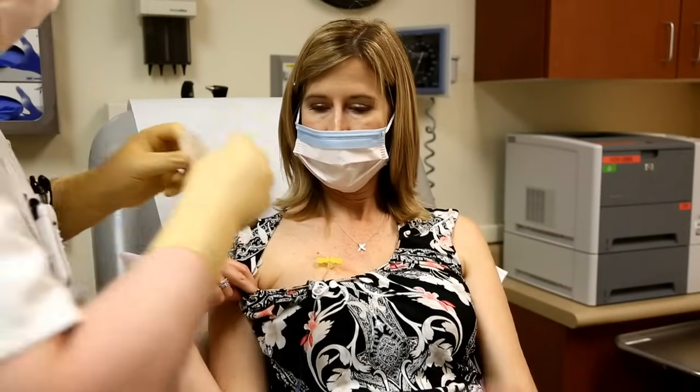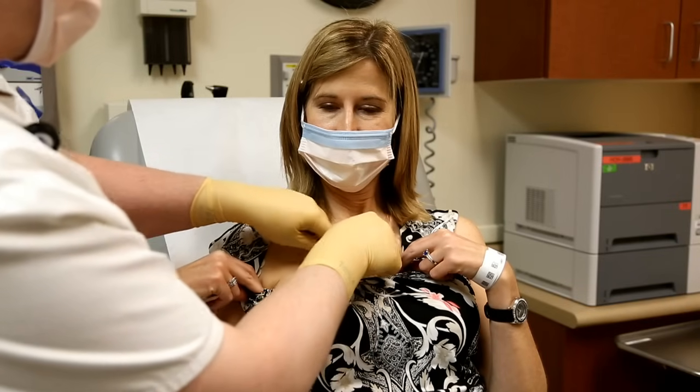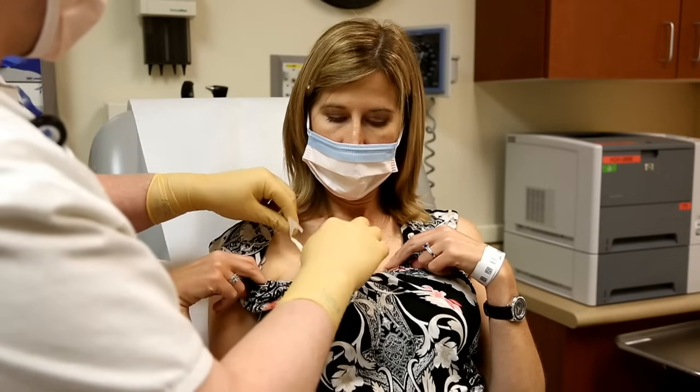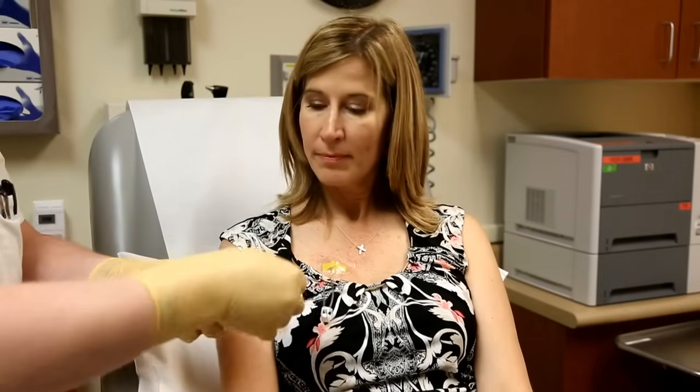We'll put our little covering over here. Does that feel okay? Yep. Once this is on and it's covered I can take this pretty mask off. One thing I recommend: make sure whatever you're going to wear when you're having your port accessed that it's easy. Otherwise I've seen people wear high-neck things and it makes it very awkward, so I try to plan what I'm wearing when I come to clinic so that it's easy to access me.